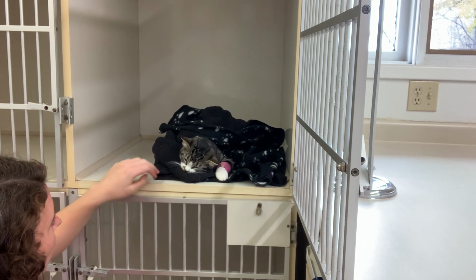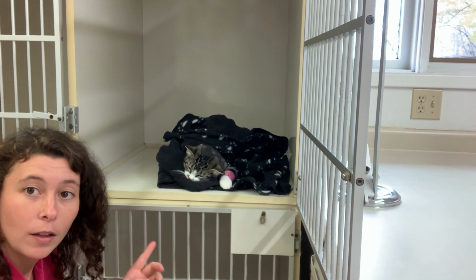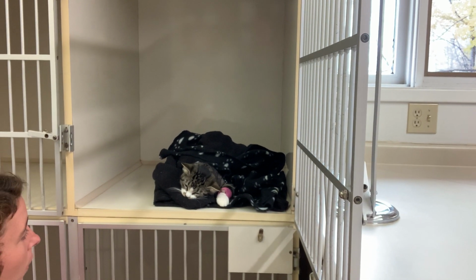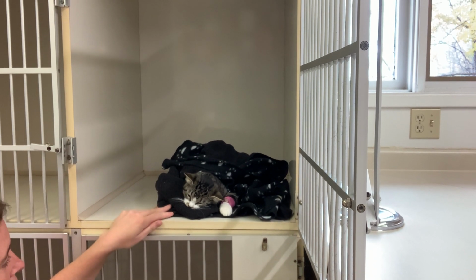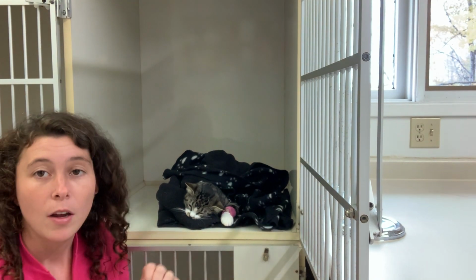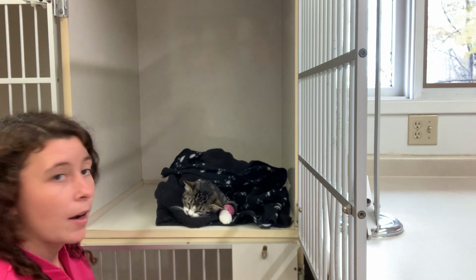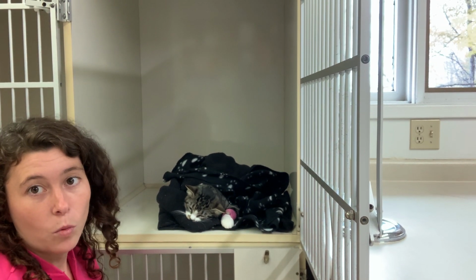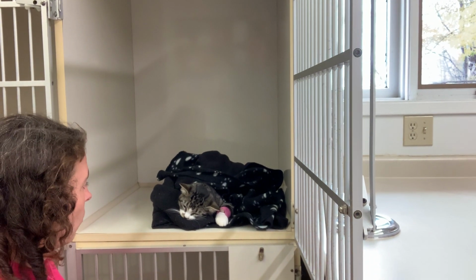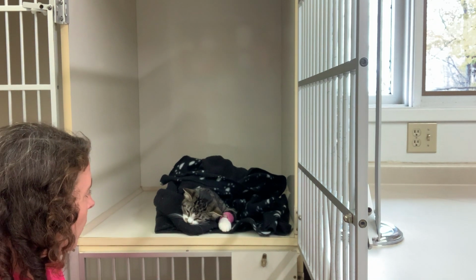And we're going to turn the light off. Now this patient cannot stabilize its head by itself, so I cannot leave this patient on its own until it is actually able to lay in sternal recumbency on its own. So I need to wait until that patient is awake enough to stay in that position by itself. So I'm just going to relax and sit with the patient, making sure it's warm, continue to check its respiratory rate, continue to check its heart rate, continue to make sure that we do have all the reflexes that we should have at this stage.